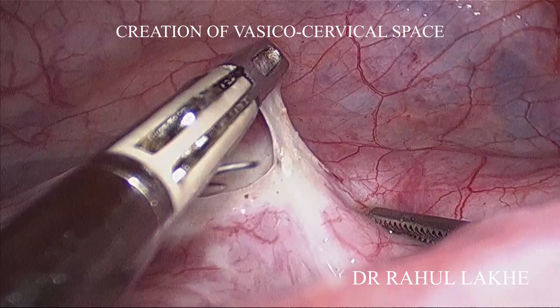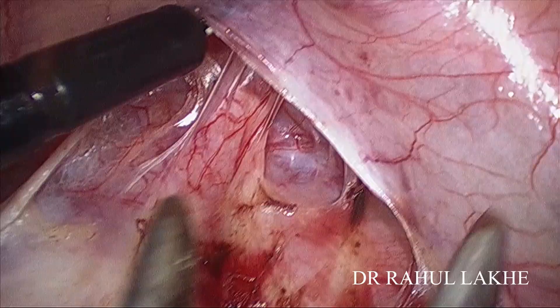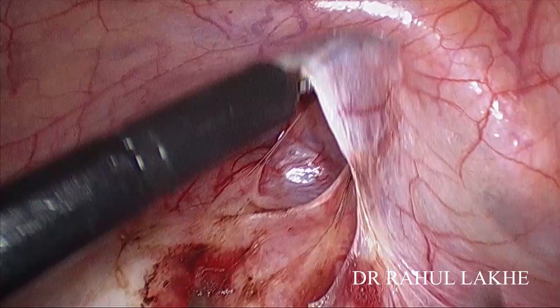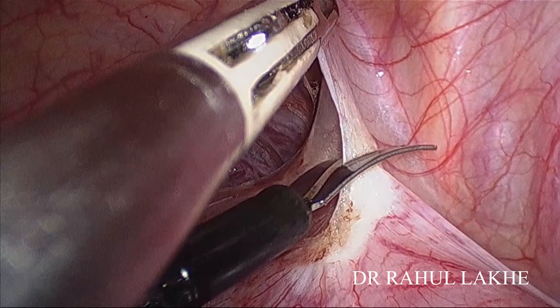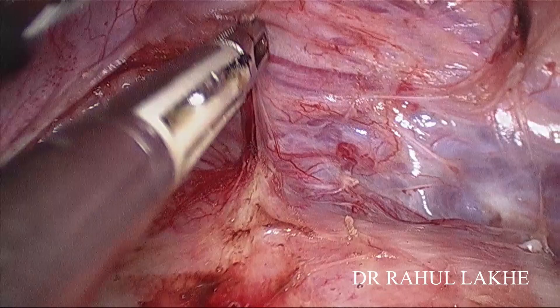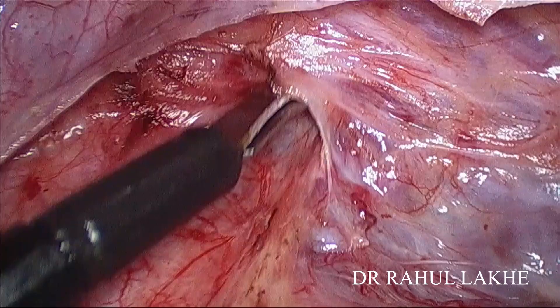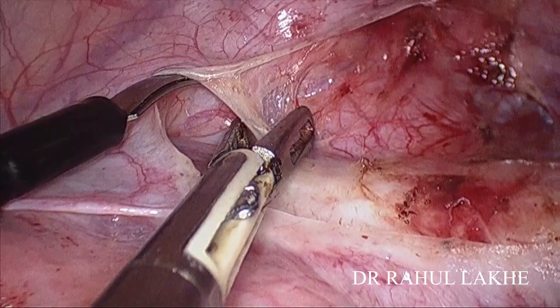Small bladder fibers are simply cauterized and cut. The loose areolar tissue is dissected down caudally to expose the cervico-isthmic junction. The peritoneum incision is extended laterally. For traction, we ask our assistant to give a gentle cranial traction with a simple Babcock forcep with jaws open. Giving traction in such cases is always a difficult task as the uterus has a baby inside — it is more soft and more vascular, so you have to be very cautious and gentle when maneuvering the uterus.